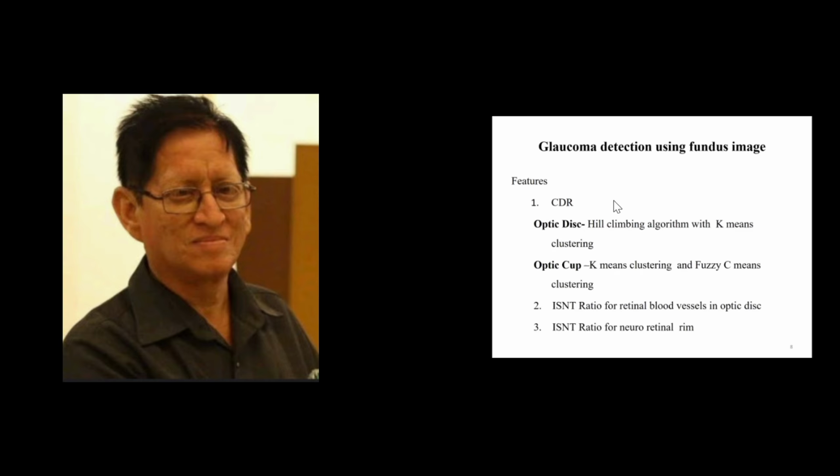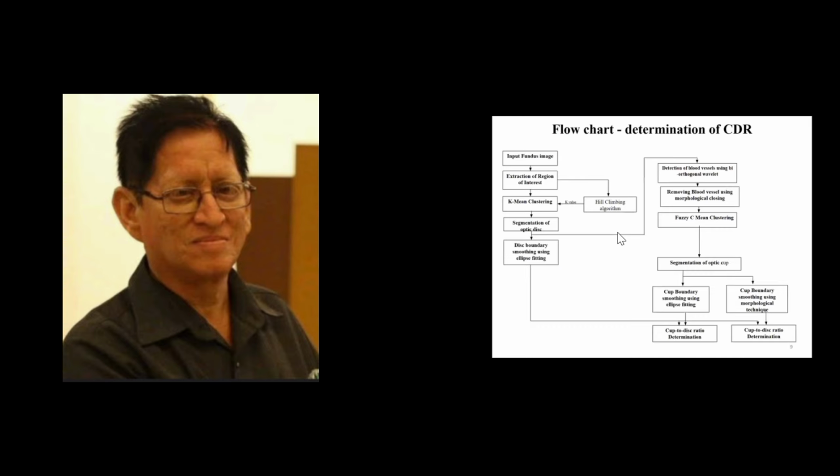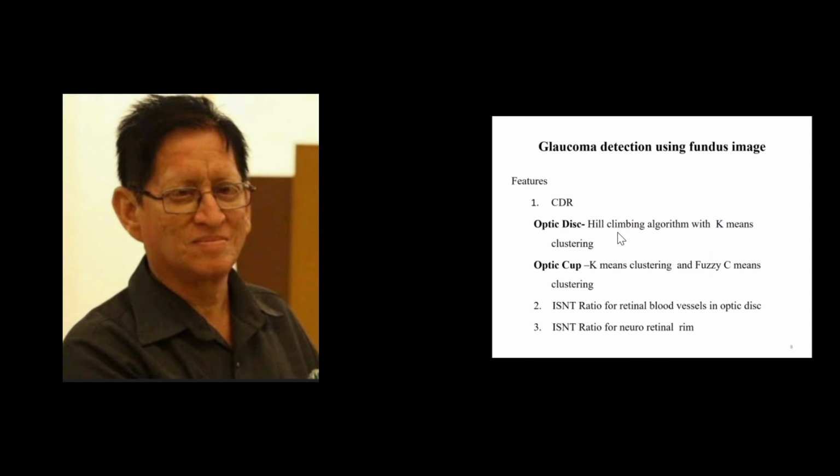First, we discuss glaucoma detection using the fundus image. The first feature is the CDR. For the optic disc, we use two algorithms, hill climbing algorithm with K-mean clustering.